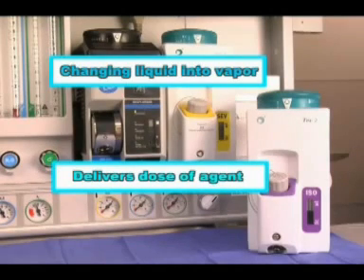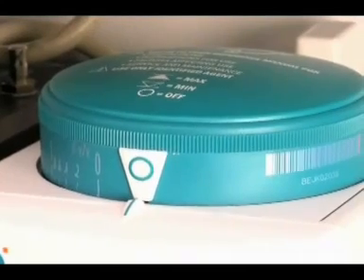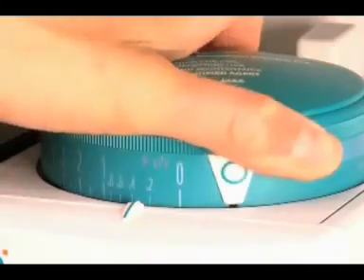The internal mechanisms of the tec vaporizer consist of features that provide a system of checks and balances to help maintain flow volumes, temperature, and pressure, which allow delivery of a set vapor ratio. Flow volumes are controlled and maintained by the concentration dial of the vaporizer.